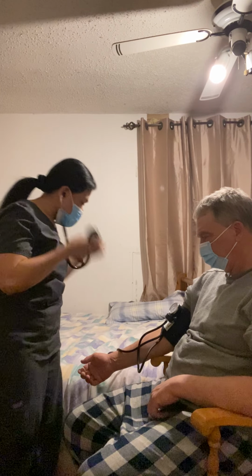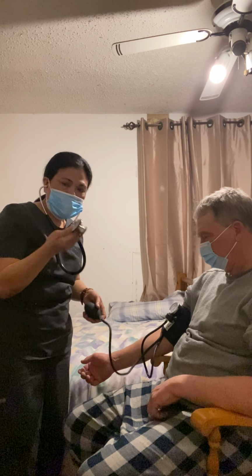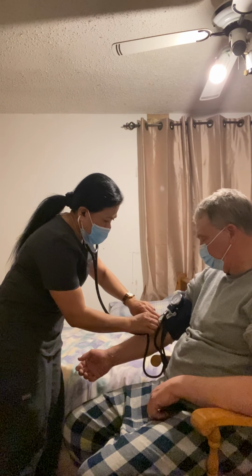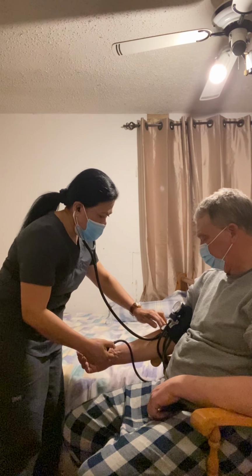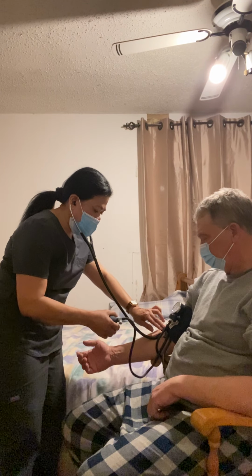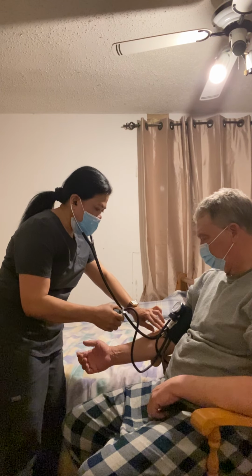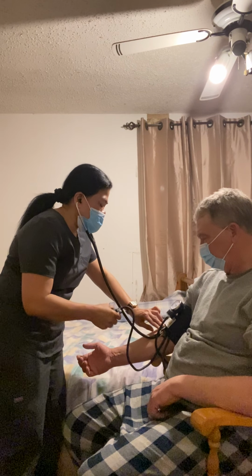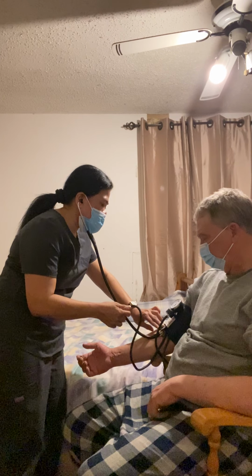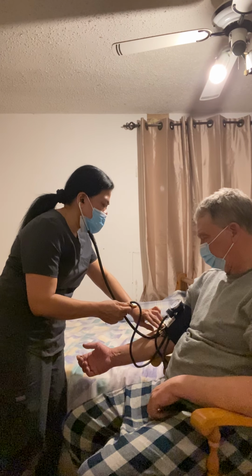So we're going to put this at our brachial artery, and then we're going to inflate, and then we're going to release slowly.